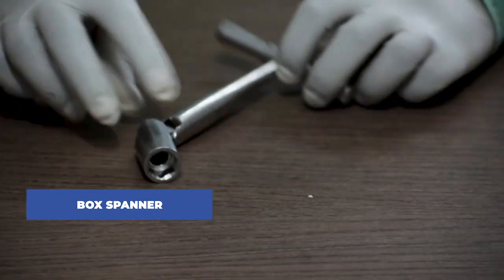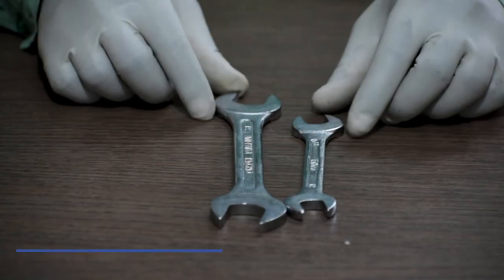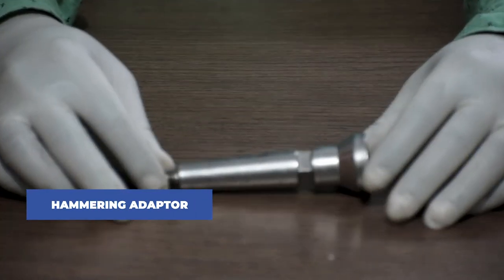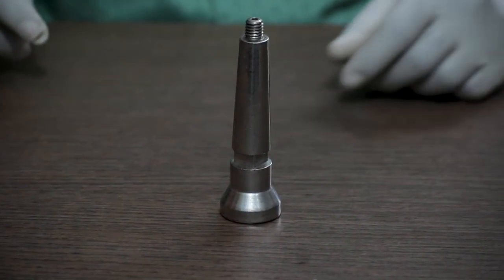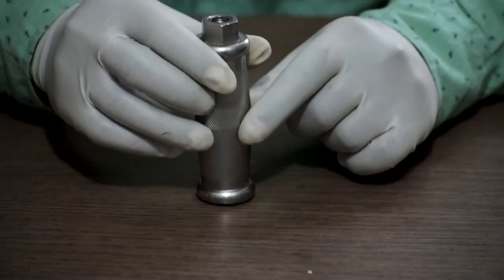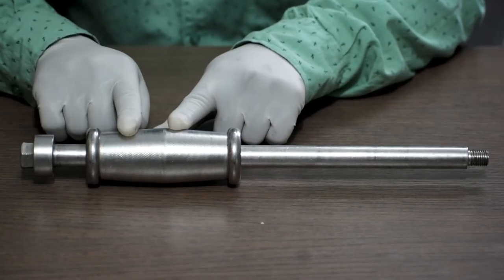Next, this is a box spanner. These are basic spanners, which is also required. This is called a hammering adapter. This is a tissue protector. This is called a hammering unit. This is called the extractor impactor rod. And this is a sliding hammer.